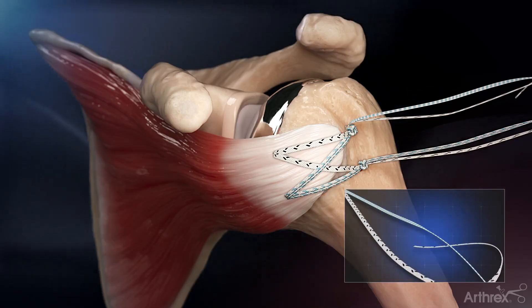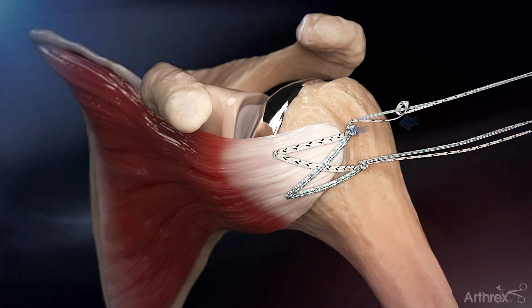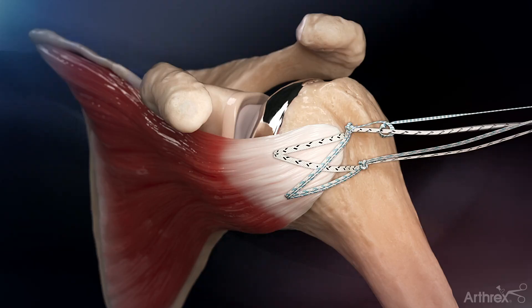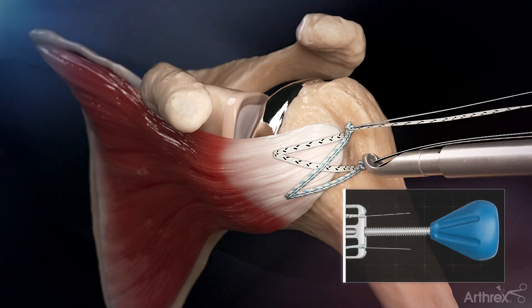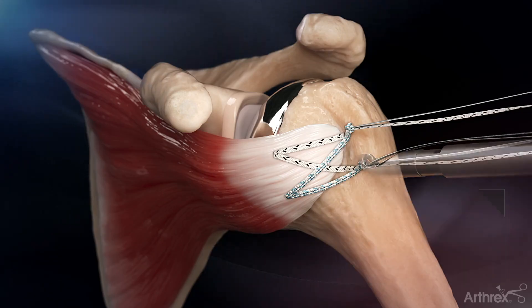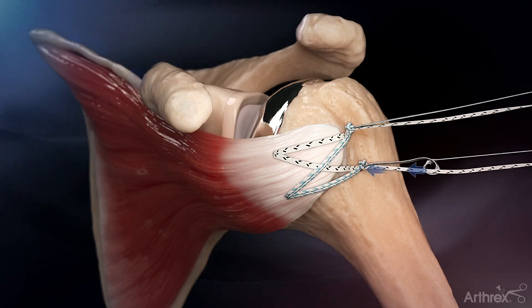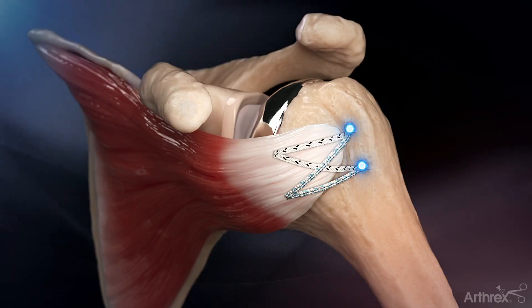Alternating half hitches are then thrown over the superior knot stack. The same tensioning steps are followed on the inferior suture limbs, and one final alternating half hitch is thrown over the inferior knot stack. If desired, suture tensioning can be repeated. The excess suture limbs are cut, which completes the repair.